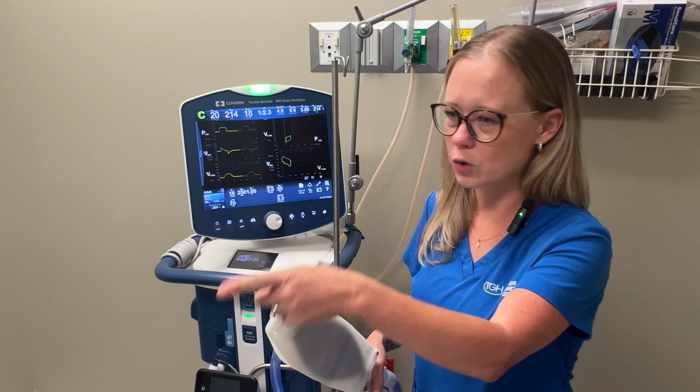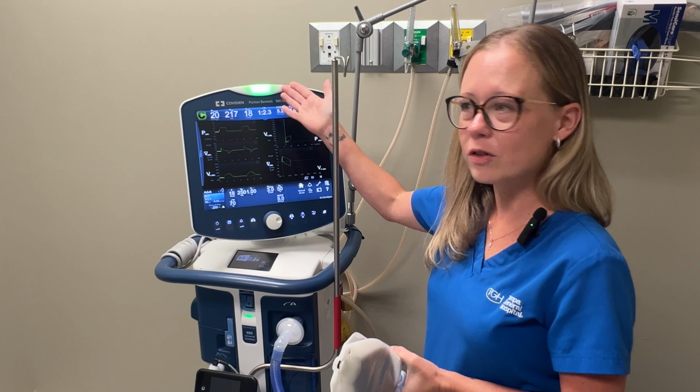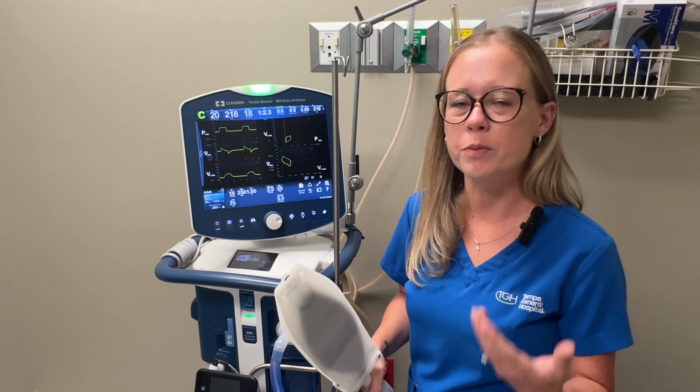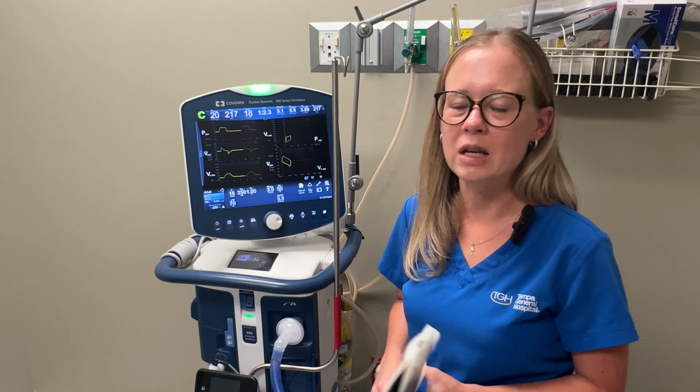That's a good indication when you're just walking past a room. You can, from the doorway assessment, you can see, is the light green, or do I have the yellow lights, or do I have the red lights? The red lights are the most serious, most critical alarms. The yellow, not critical, but something that may need attention.